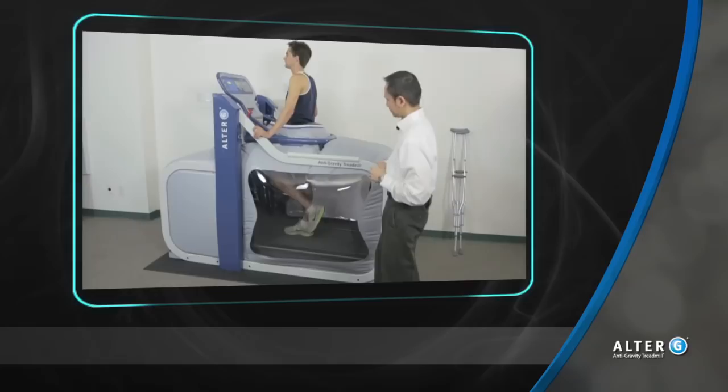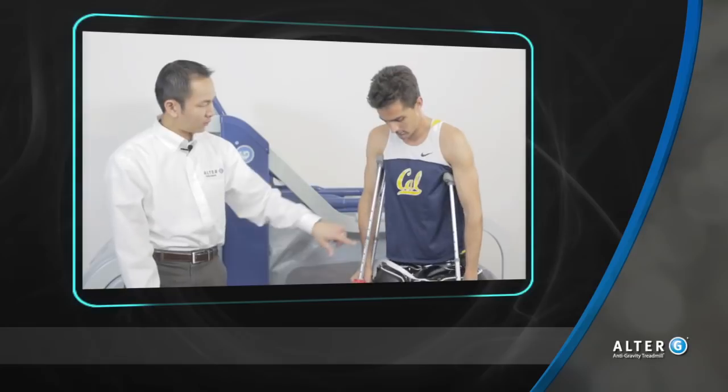When the session is completed, make sure the patient is holding up the involved lower extremity when body weight is being reintroduced. Help the patient off of the Alter-G without stress to the injured lower extremity.